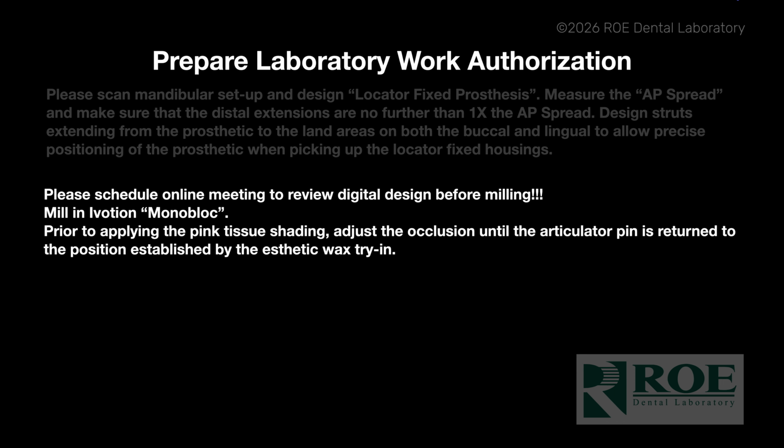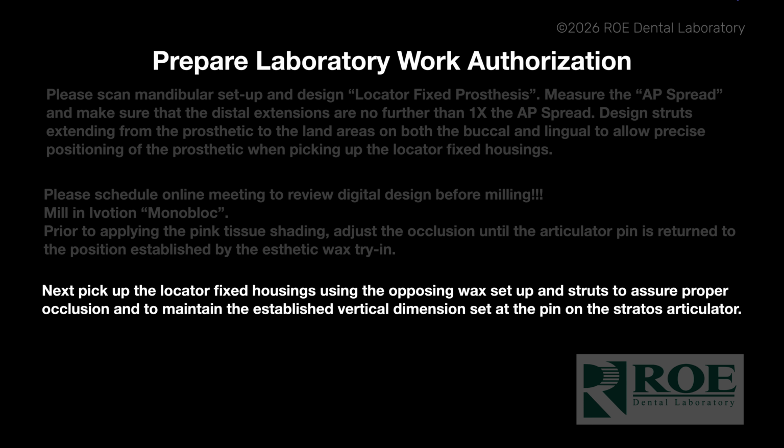And we're going to go through these laboratory steps so this makes a little more sense. Also, I'm going to tell them to pick up the LOCATOR Fixed housings using the opposing wax setup and the struts to assure proper occlusion and maintain the established vertical dimension set at the pin on the Stratos articulator.